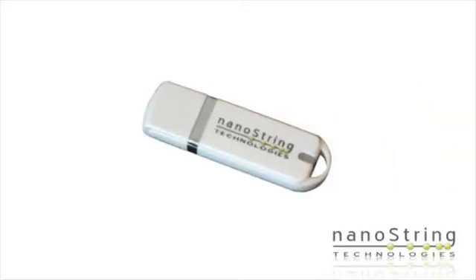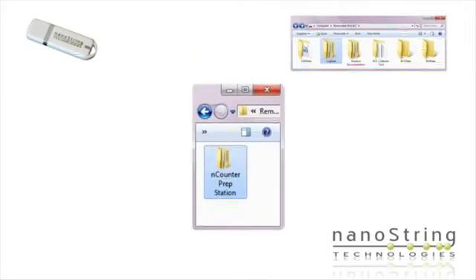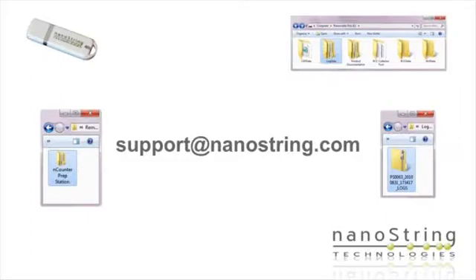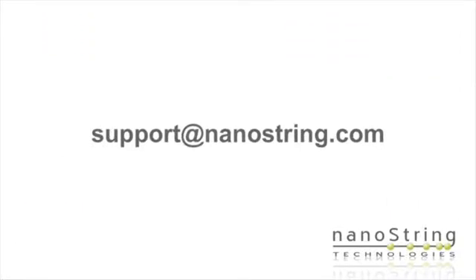On the USB stick, a folder called Log Data will be created, and then information containing the logs will be deposited into that folder. All the log files will be contained within a single zip file. The zip file will be dated with the date of the creation of the zip file. Simply email that zip file to us at NanoString. Use the address support@nanostring.com together with a short description of the problem or problems you have seen and caused us to ask for the log files.